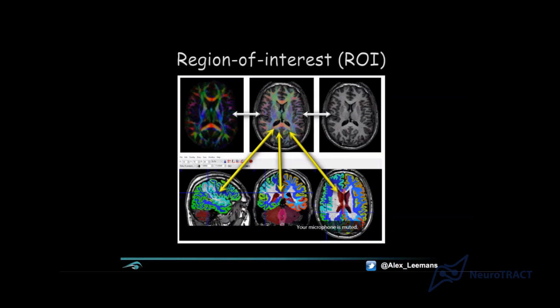And obviously, if you have a tool that can segment out and parcellate the cortex into multiple regions that have, for instance, functional relevance or underlying cytoarchitectural specificity, then you could use those regions as nodes in a network analysis, or to keep it simple, why not just look at the diffusivity properties in those regions, averaged within a region.